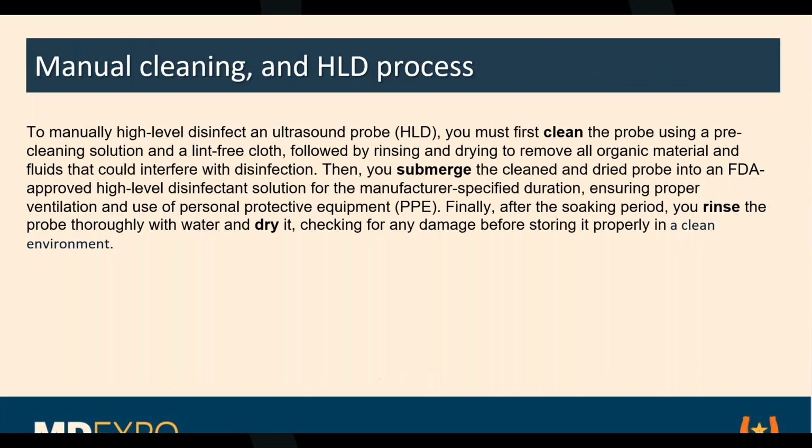So the documents give instructions on how to manually high-level disinfect an ultrasound probe. It's for the people in hospitals right now. Do you know what they do? Do you have automated disinfectant devices for probes, or is it still being manually cleaned? Anybody? Automated? Okay, great.